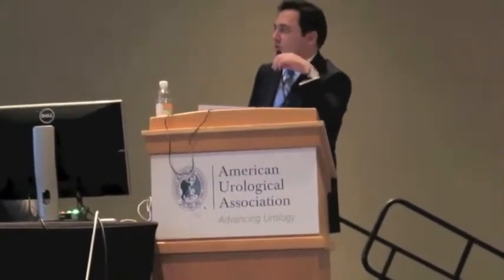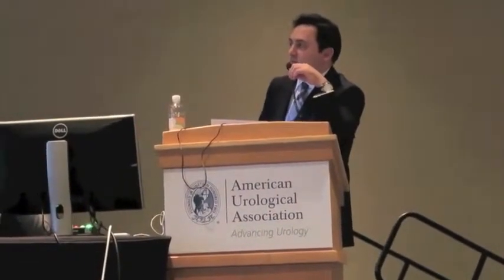You see the prostate lateral lobes, and I remove only the urethra. You see exactly. But I don't do this in my cases who have a gross apical tumor in MRI, or only biopsy positive in apical part of the prostate. But the issue is to remove the urethra from inside the prostate.